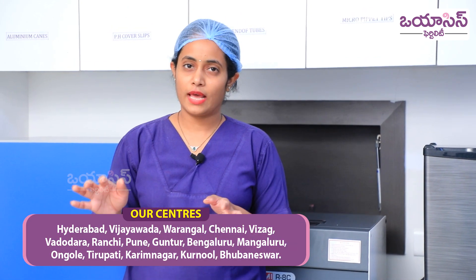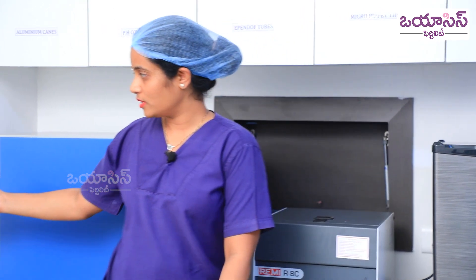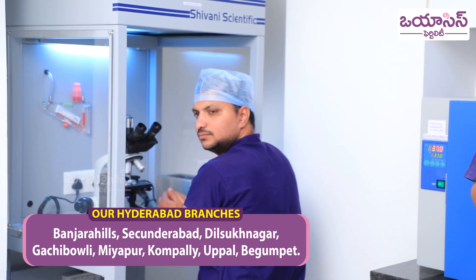This is our andrology lab, which has all the incubators and a microscope, and he is our andrologist. The most important factor in IUI preparation is a good andrologist — it directly depends on the success rates.